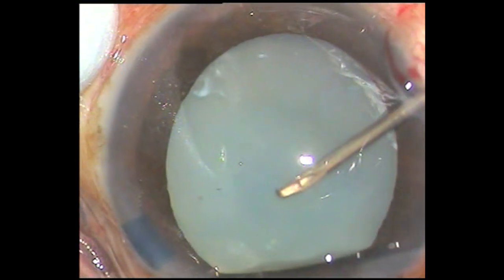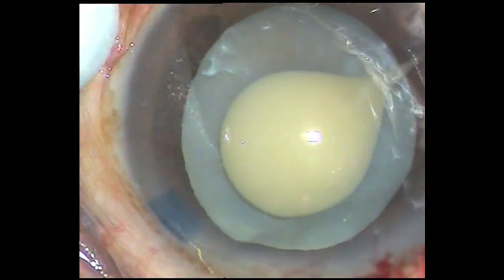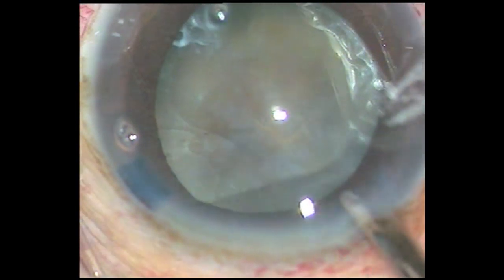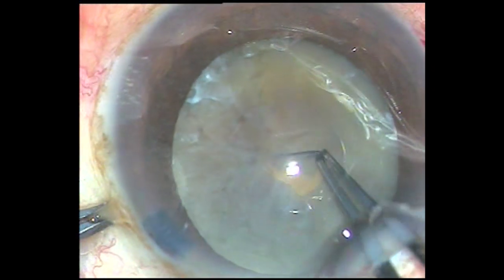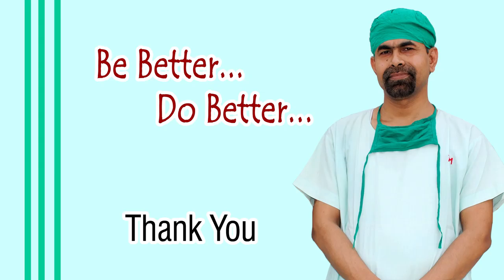In some hypermature Morgagnian cataracts, as we make a puncture on the anterior capsule, a lot of milky fluid comes out. In such cases we can aspirate the milky fluid without converting the puncture into a small rhexis. After aspirating, we inject visco and convert the rhexis into an optimum-sized one.